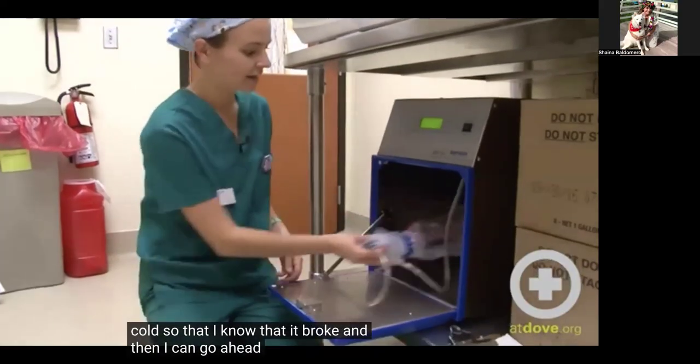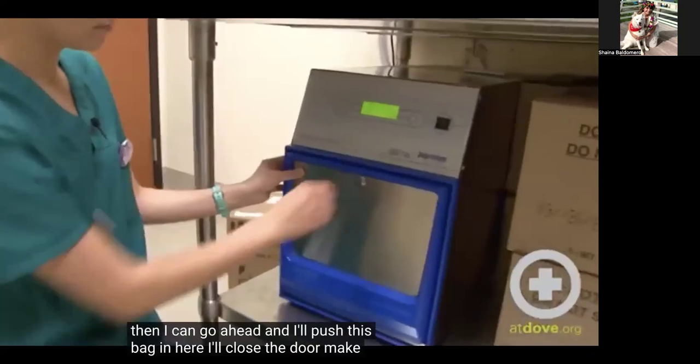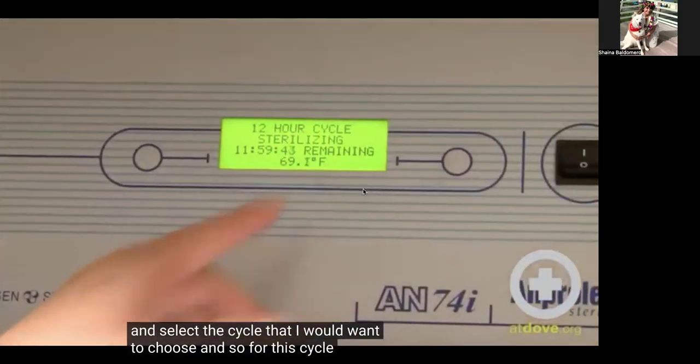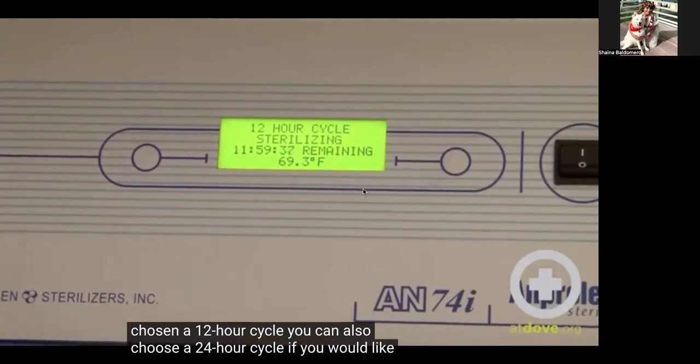And then I can go ahead and I'll push this bag in here. I'll close the door, make sure it's locked. And now I can go ahead and select the cycle that I would want to choose. So for this cycle, I have chosen a 12-hour cycle. You can also choose a 24-hour cycle if you would like.